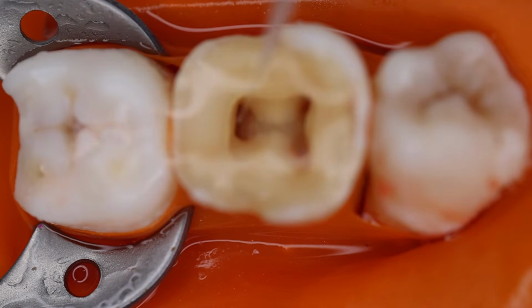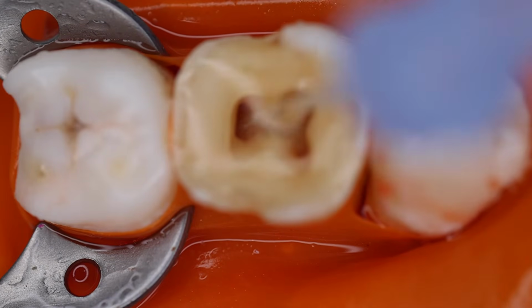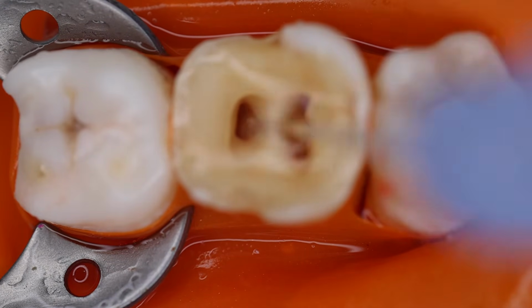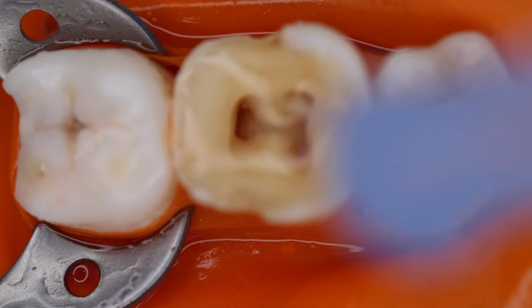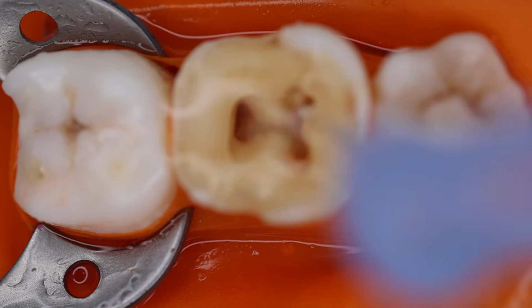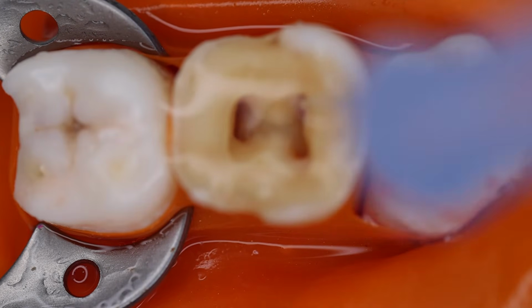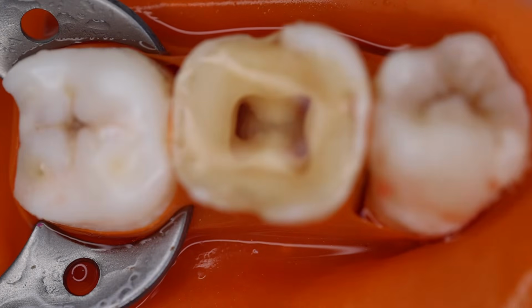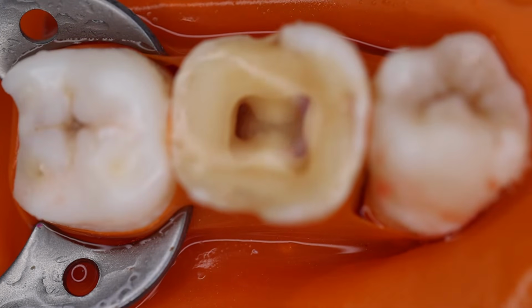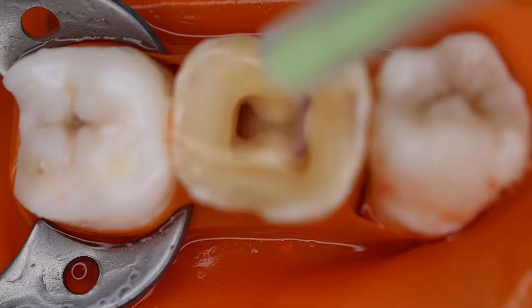And I would like to ask you, why could the first irrigant be sodium hypochlorite? This sodium hypochlorite should be freshly poured from the bottle into the container that you are using, and it should not be kept well before the patient's access opening has been started. The freshly poured sodium hypochlorite would take around 15 to 20 minutes to effectively get the organic debris dissolved or necrosed.